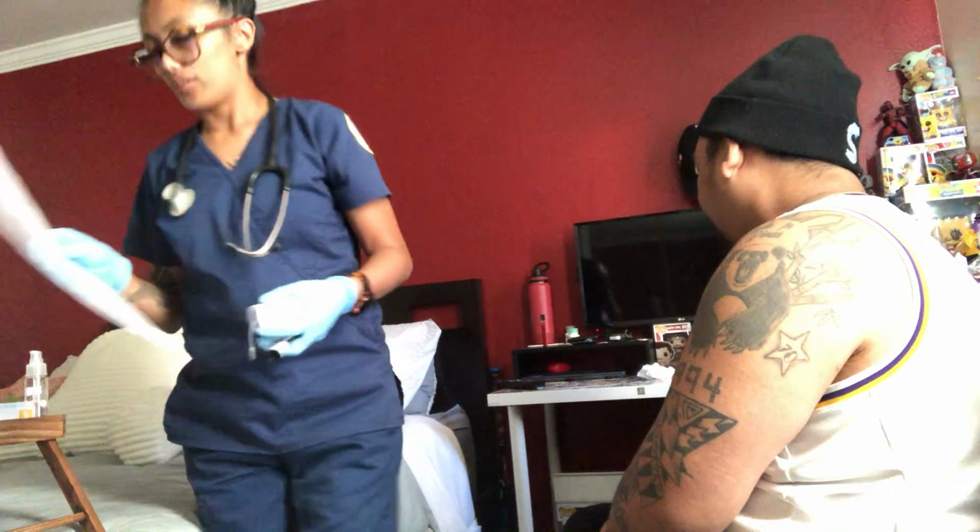Thank you. So after leaving the patient's room, I am going to let the nurse know what I found and what was helpful. And then I would also document it and let the physician know how the patient reacted to the learning of the inhalers. And after that, I would take my gloves off and then sanitize my hands again. And that will be the end of my metered dose inhaler and dry powder inhaler competency. Thank you.